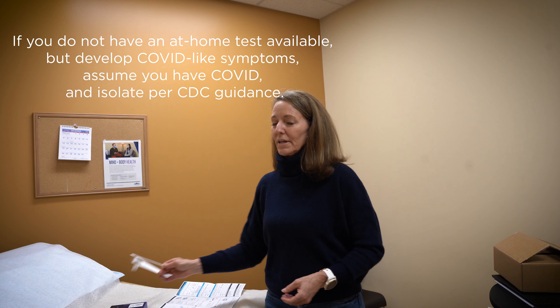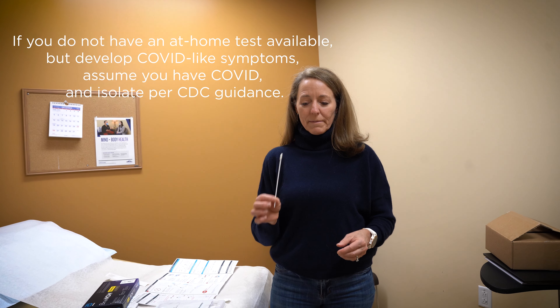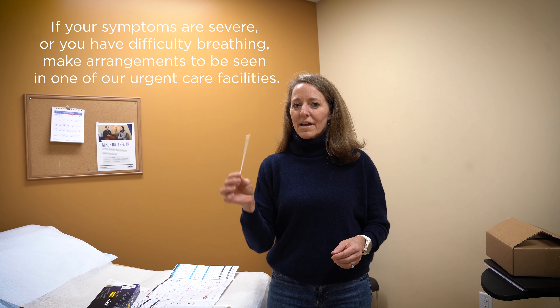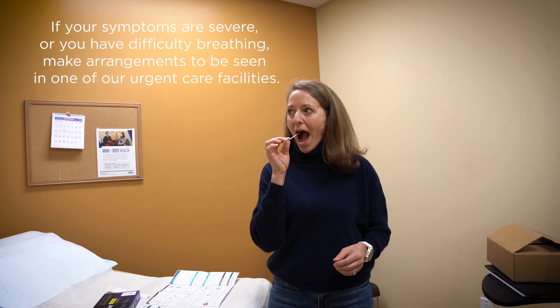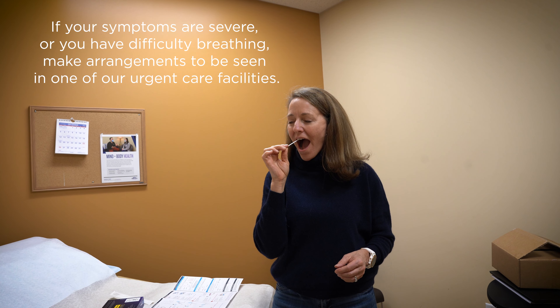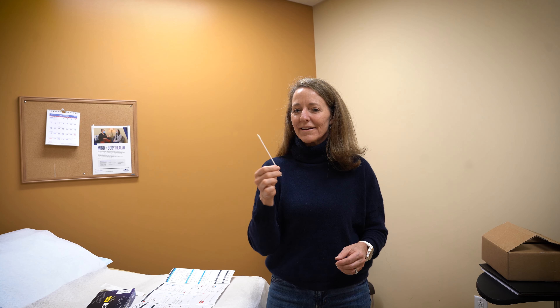The swab has to go in far enough. So first of all, I'm going to do my throat first. I'm going to open up really big. Give it a little tickle until you choke — it has to go way back in there.